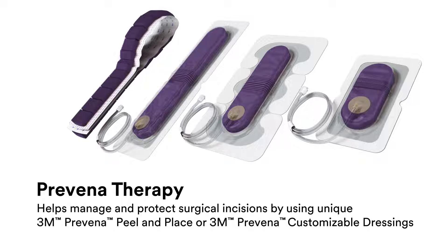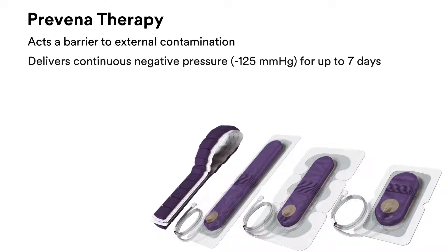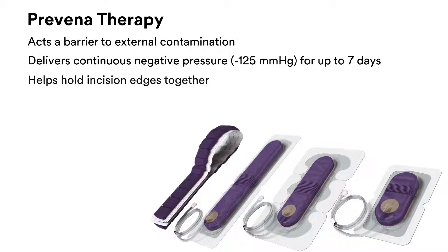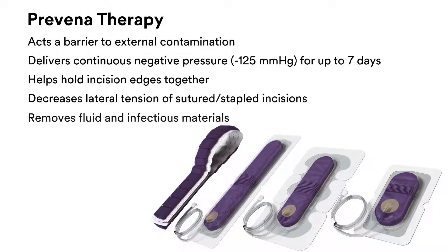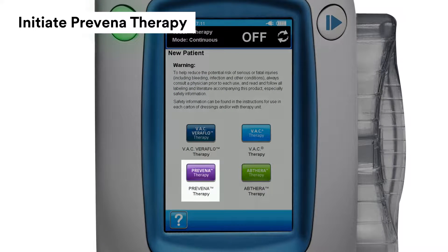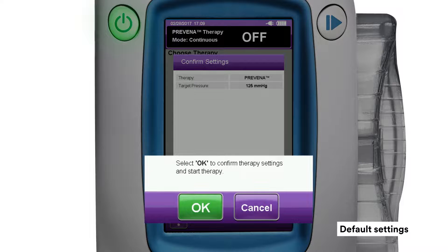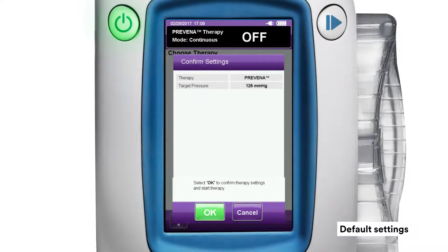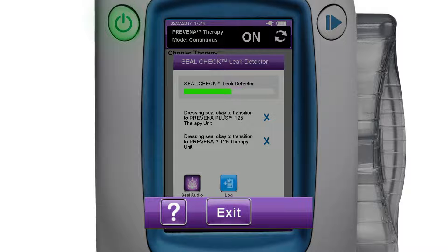3M Preavena therapy helps manage and protect surgical incisions by using unique 3M Preavena peel-and-place or 3M Preavena customizable dressings, acting as a barrier to external contamination, delivering continuous negative pressure for up to 7 days, helping hold incision edges together, decreasing lateral tension of sutured or stapled incisions, and removing fluids and infectious materials while reducing edema. To initiate Preavena therapy, press the purple Preavena therapy button, then press the green OK button on the confirmation screen to accept default settings and begin Preavena therapy.